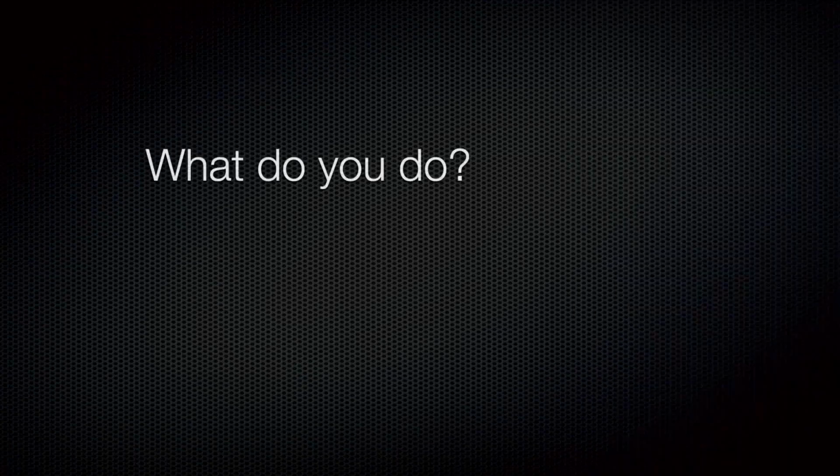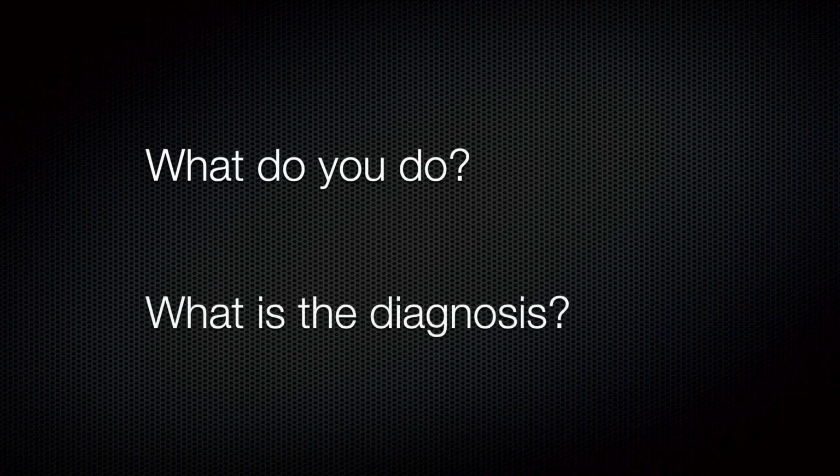What do we think is going on, and what can we do about this? What do we do next as we're taking care of this patient in the emergency department? And ultimately, the other big question in the back of our mind: what's the diagnosis that this patient is going to have? By virtue of the fact that we're talking about the kidneys, we can easily say, oh yeah, this is the kidney that's the issue, but what specifies that down into what's going on here?